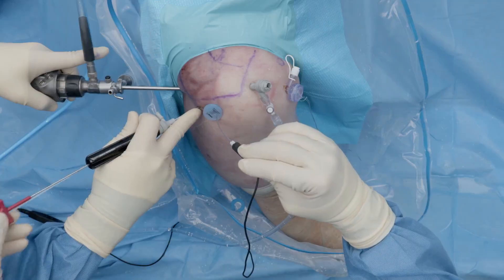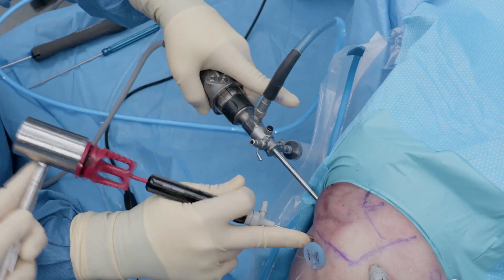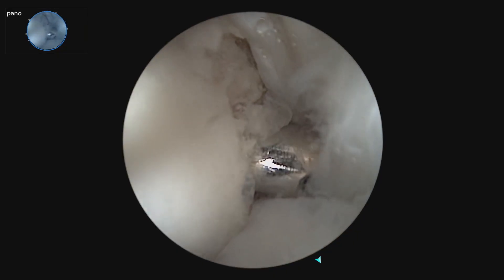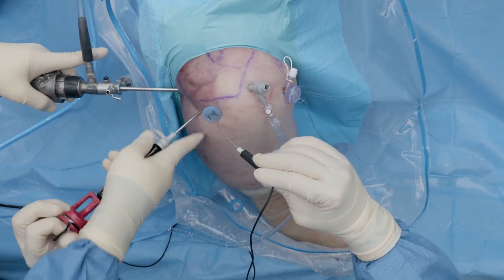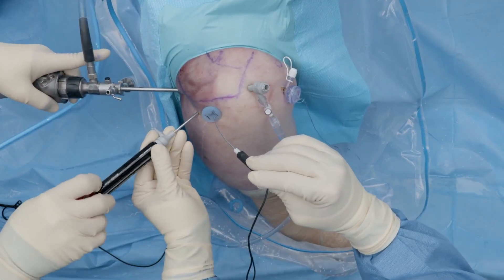After drilling, we insert the anchor and mallet it in flush. After malleting it in, we make sure it's well seated, remove the rubber grommet, and remove the anchor driver.